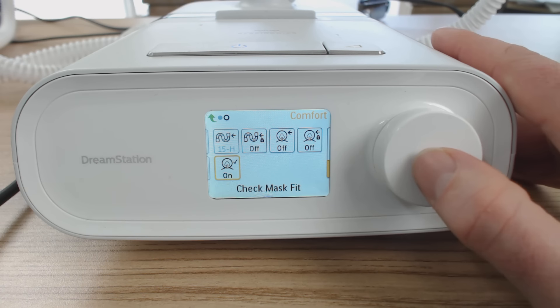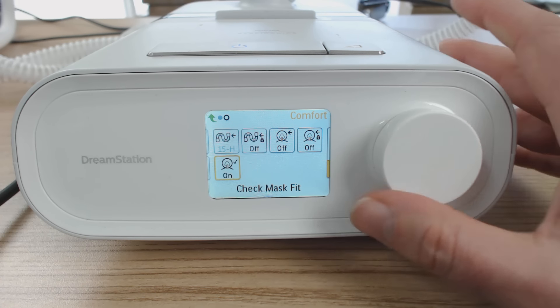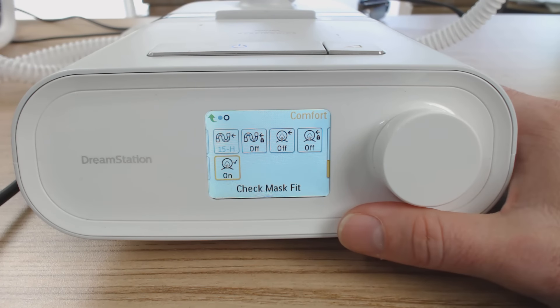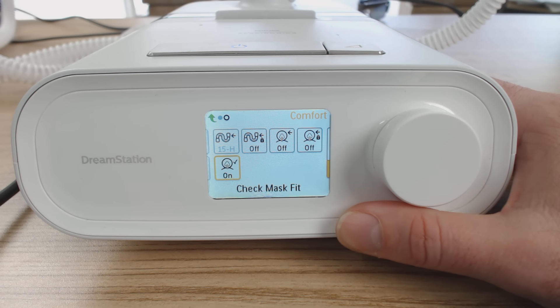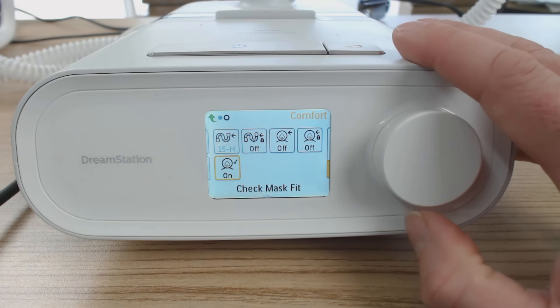Check mask fit — we definitely want that on, because it enables you to put your mask on and run the check mask fit mode before you go to sleep, which gives you a green tick so you know your mask is fitted correctly. You know that when the pressure goes up while you're asleep, the mask is going to seal correctly, and that way you're not going to be woken up by mask leaks.